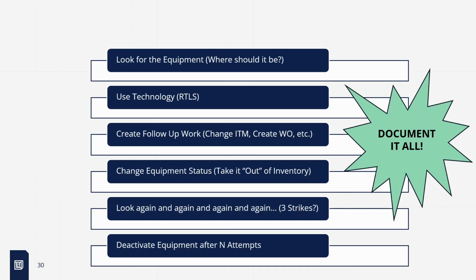I did the inspection on this. I might not be able to do the full testing to make sure your dosages or voltages or whatever are correct, but it is in use. It is keeping someone alive. So it technically passes the visual inspection part. Again, that's from Kelly Proctor from DMV, who used that as an example. If he's here, stand up. I'd be honored if he was here.